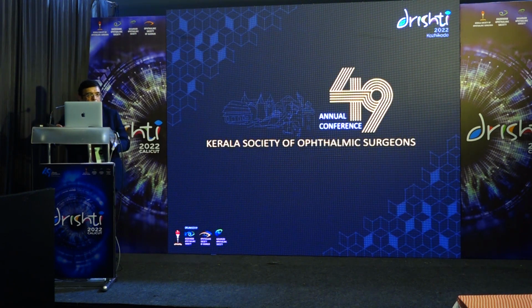One more question, sir. You said something about oral fluorescein angiography. What is the percentage? How many ml will you give? So what we used to do, we used to take 2 vials of 20% fluorescein mixed in orange juice, about half a glass, and ask the patient to take it, record a basic SLO angiogram, and then we used to record it almost every 4 to 5 minutes. After the 10th minute, we almost record it every minute because it's a very slow process. And we generally get a reasonably good angiogram for basic interpretation.